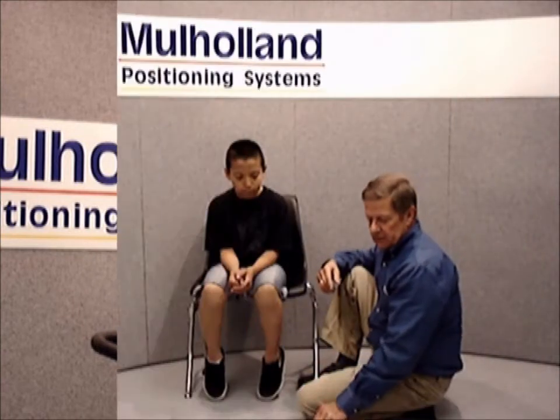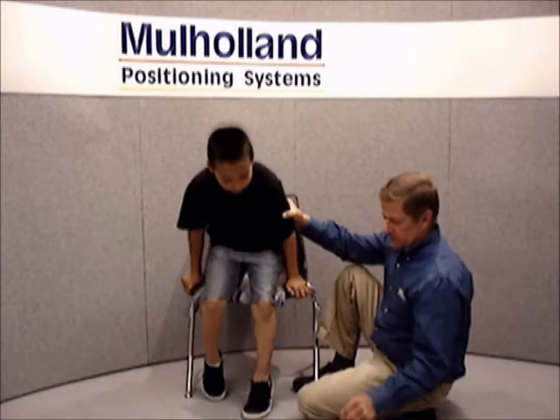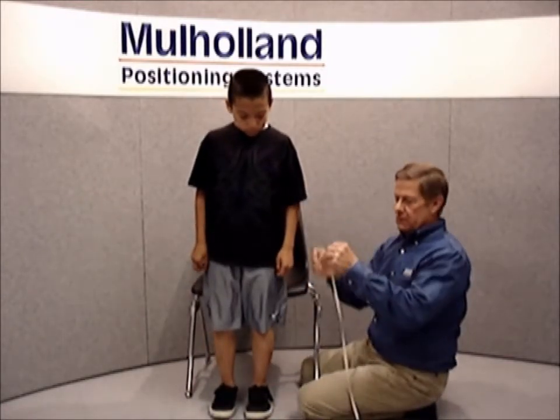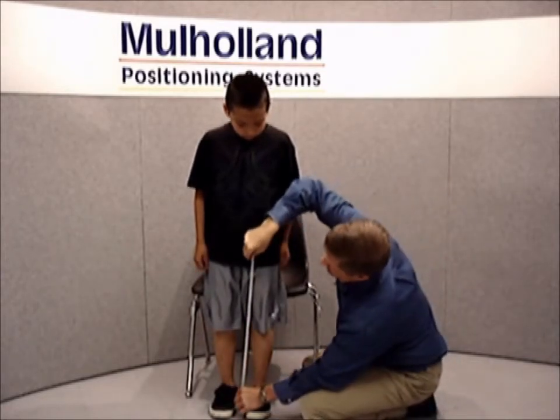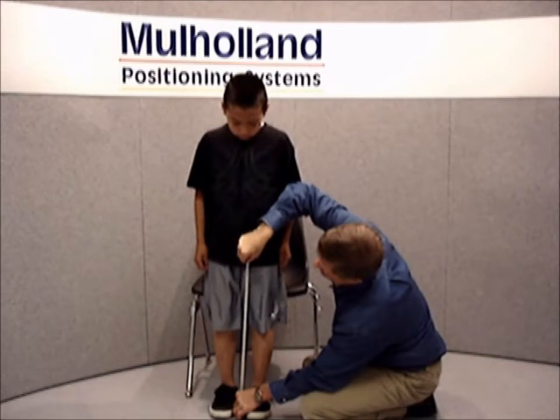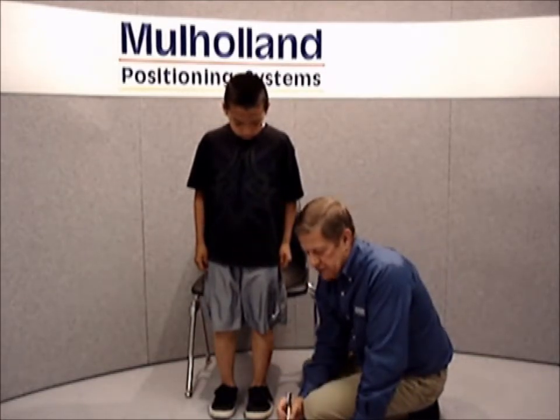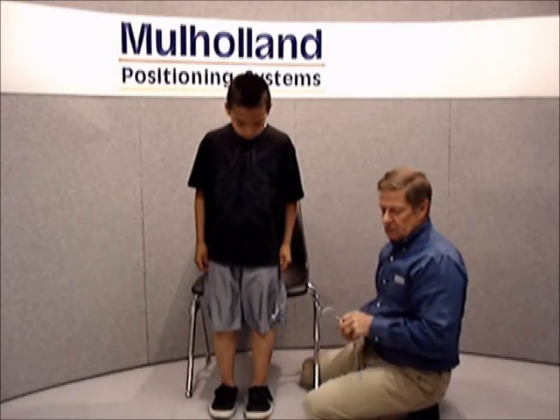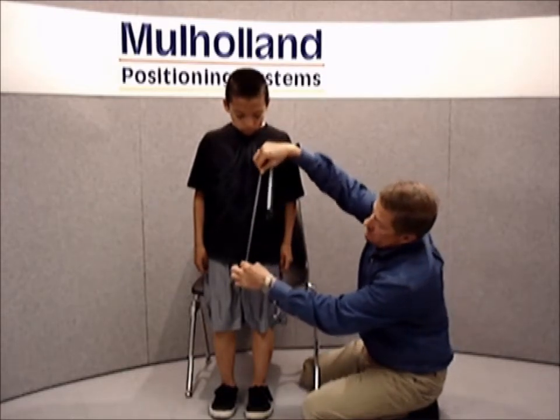Our first measurement, measurement number 1, is the inseam measurement. This can be taken with the user standing or supine on a mat or bed. This measurement, when taken, you need to add 2 inches. The next measurement is the crotch measurement to the sternum, or inseam up to the sternum.